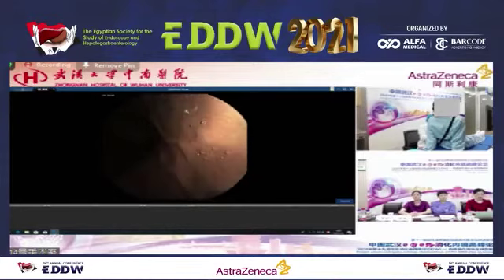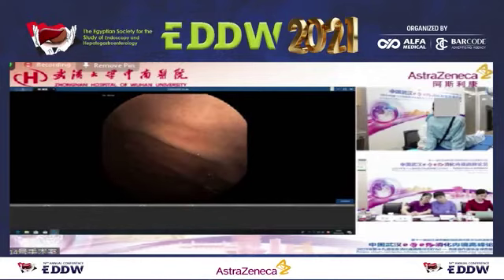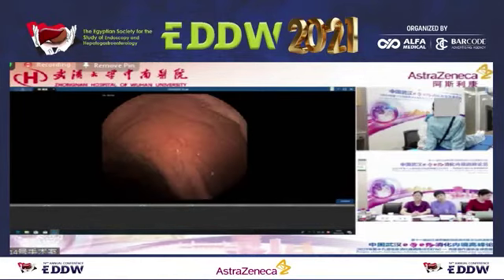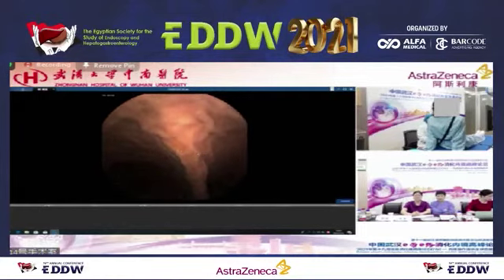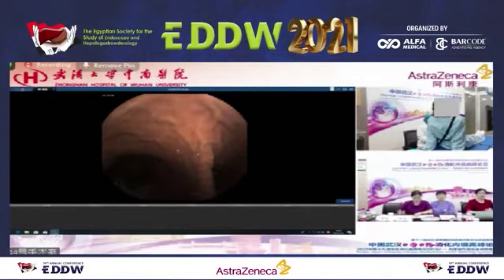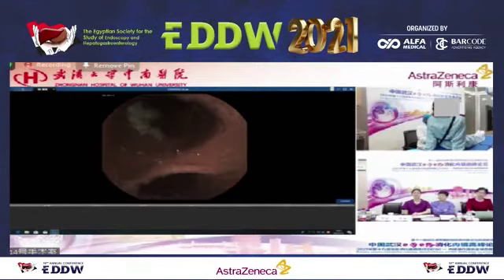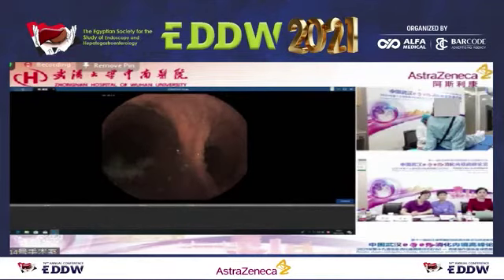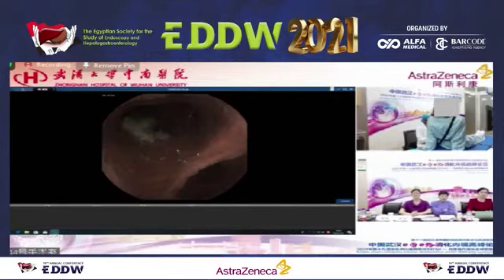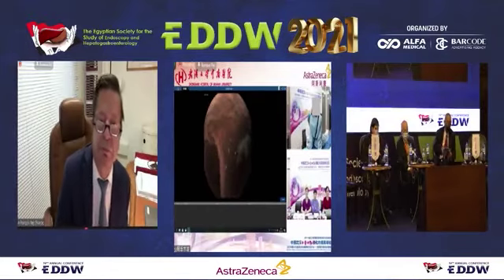This picture shows us the whole stomach.